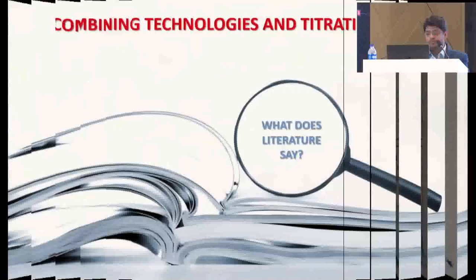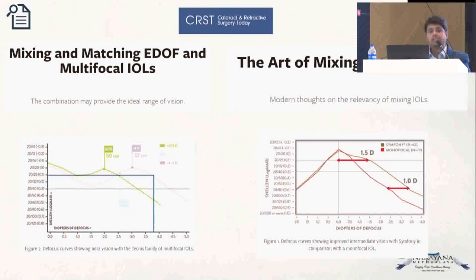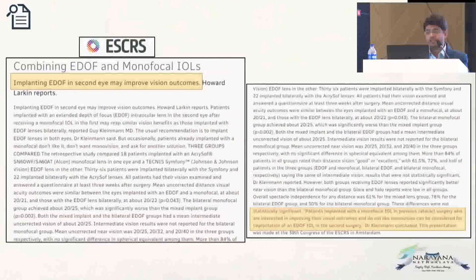You can also combine technologies, with a monofocal IOL in one eye and a trifocal or an EDOF in the other eye, or a trifocal in one eye and an EDOF in the other eye. All of this will also depend upon the defocus curves of the respective lenses. There are multiple papers that prove that you can combine different technologies and the patients do end up becoming happy, especially if the patient really requires it. If the patient has come with a monofocal in one eye and is asking for near vision in the other eye and binocular spectacle independence, you can go ahead with an EDOF lens. There are studies that also talk about using a trifocal lens, and thus you can mix and match IOLs.